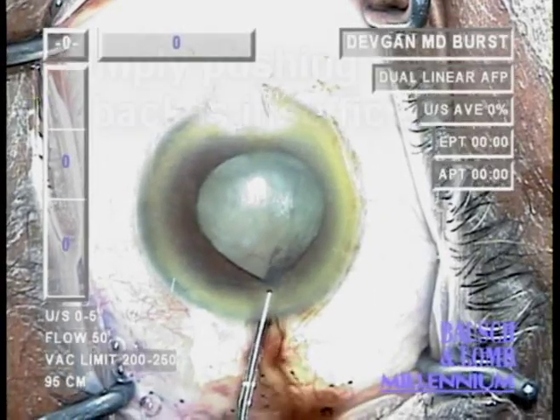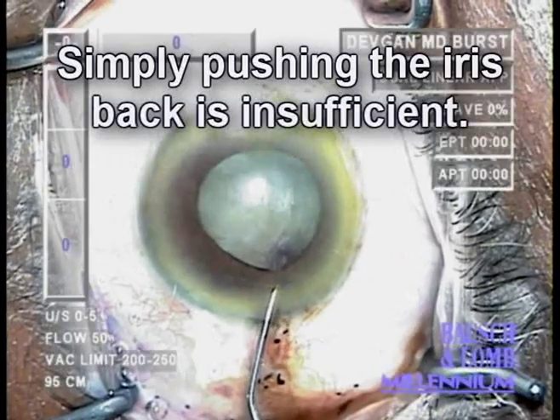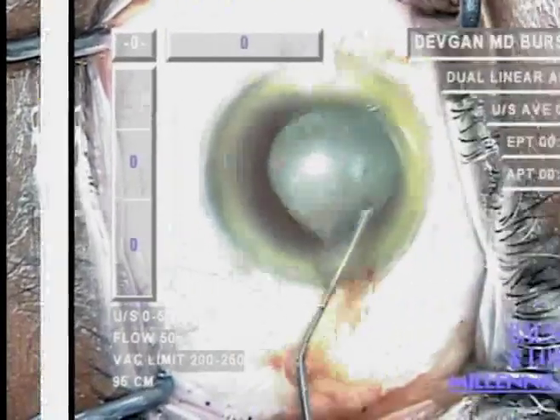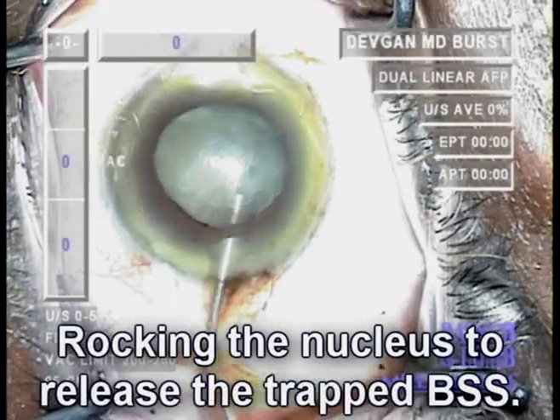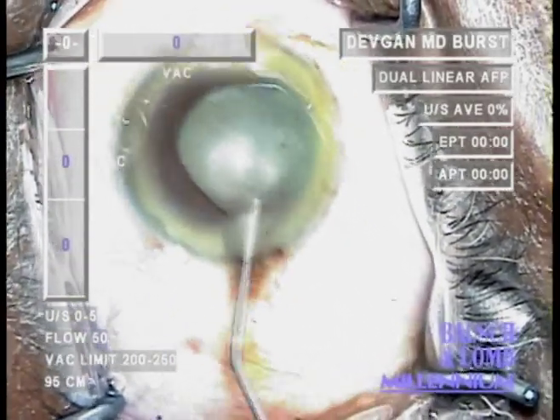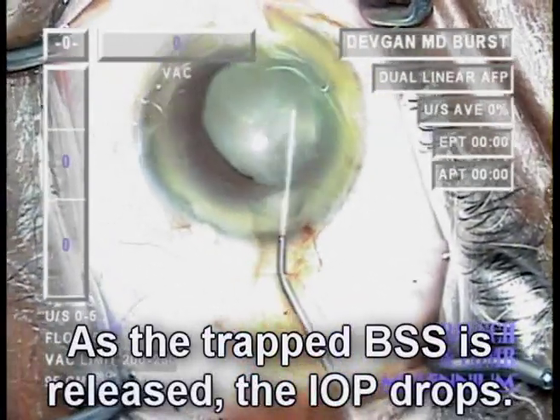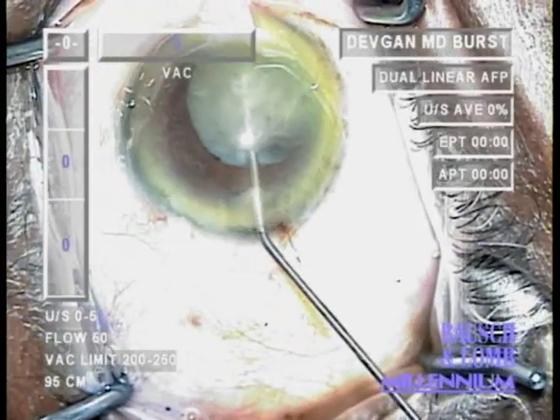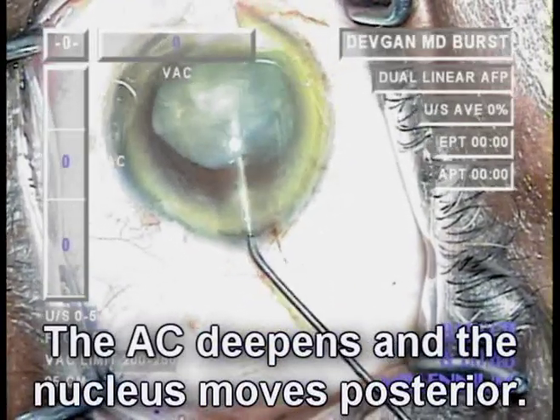Remember, just pushing the iris back into the anterior chamber is insufficient and will not work. Instead, what we're going to do is release the trapped balanced salt solution by rocking the nucleus. Note that we're very lucky that we didn't blow out the posterior capsule during hydrodissection — that could have happened as well. As we release this trapped balanced salt solution, the pressure drops, and when the pressure drops, the nucleus moves posteriorly as the anterior chamber deepens.